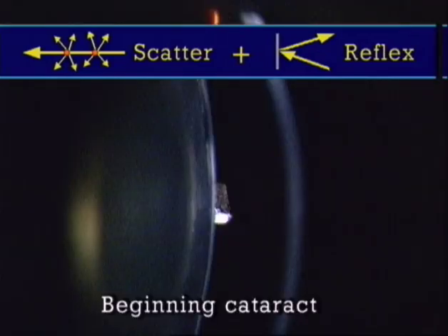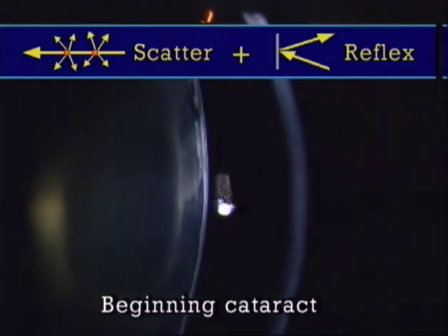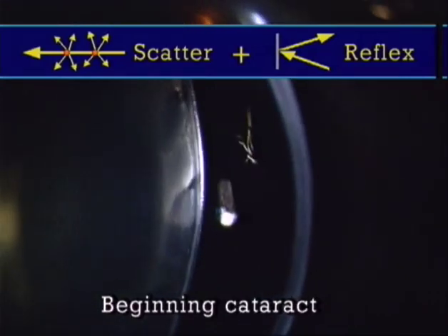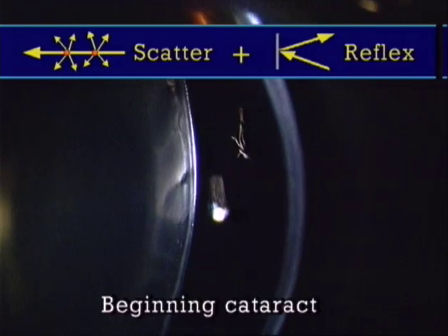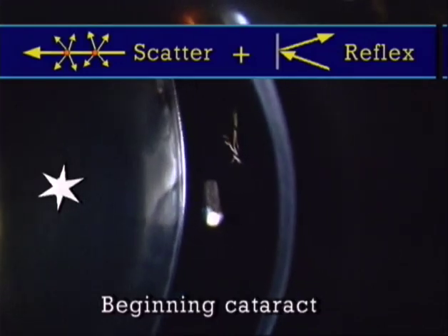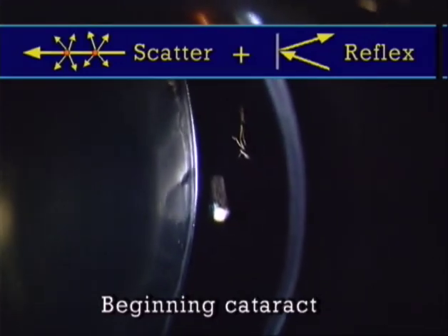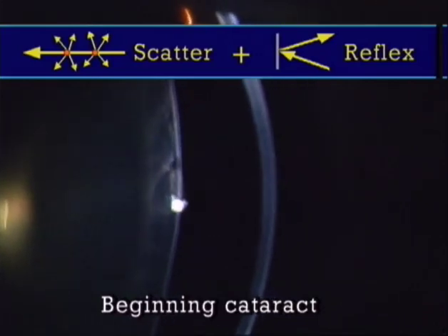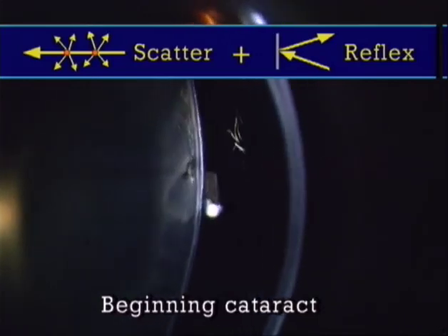This can be seen even more pronounced in this example of a cataract in its early stage. The specular reflexes in the optical section enhance the very first signs of the commencement of the lens change with water clefts. The nucleus shows no such zones, and this is a sign of the beginning of condensation. Remember that an area of specular reflection is small compared to the wide area of scattered light.